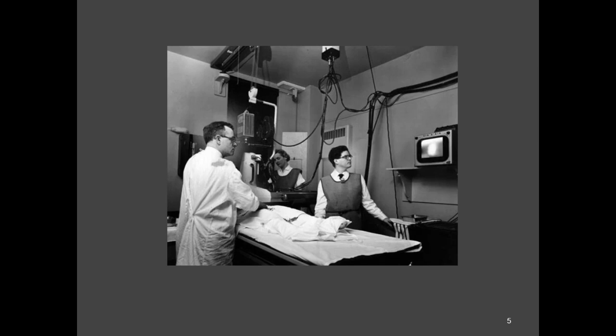This is a cine dome camera. We didn't have road mapping, we didn't have reference, we had the cine dome. Basically it's a motion picture camera with motion picture film in it. As the procedure went on, they would film the output of the image intensifier. In an upcoming slide, I'll show you how that got processed and reviewed. So this here is your reference and your roadmap of the time.